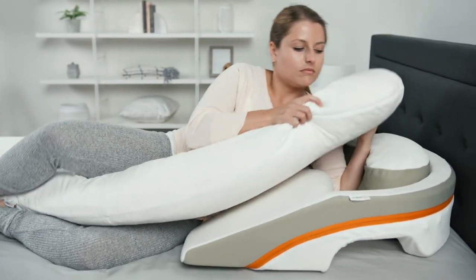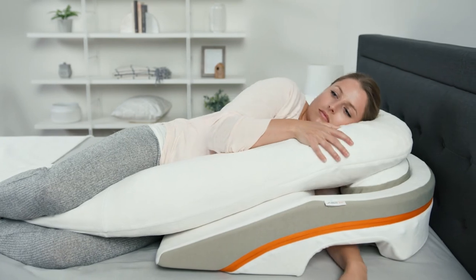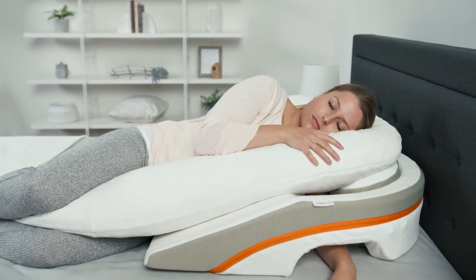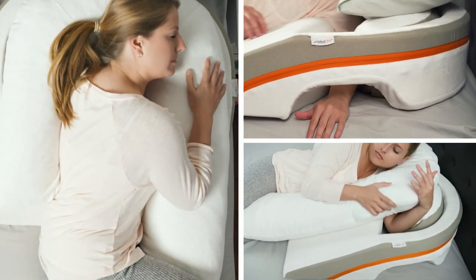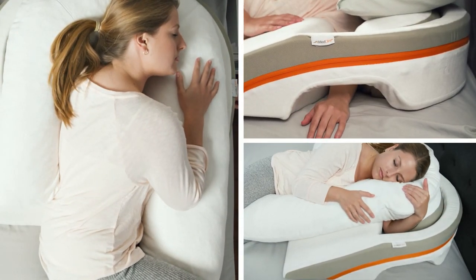As a final tip, it's perfectly normal for it to take some time to adjust to the new sleep position created by MedCline. We encourage you to experiment with various arm, neck, and head placements to find what works best for you.